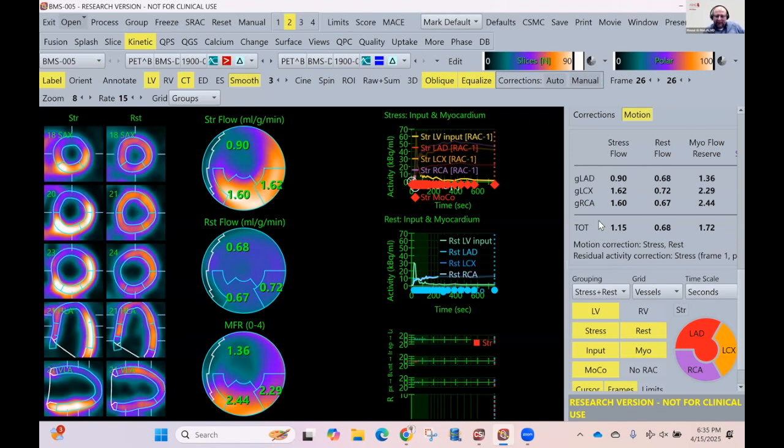Although I have to say that we've been using it, and let's put it this way, where flow is low, and where you expect it to be high, you find it high. It's just the cutoffs that are not very clear. And whenever you draw a cutoff at 2, 1.9 is not very different from 2.1. So I think you have to look at it.